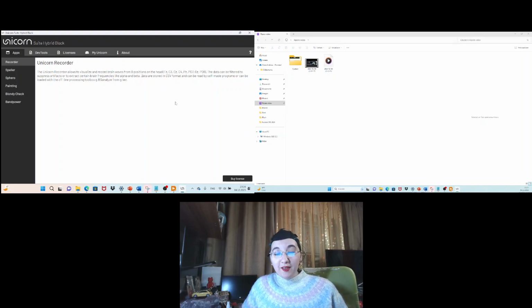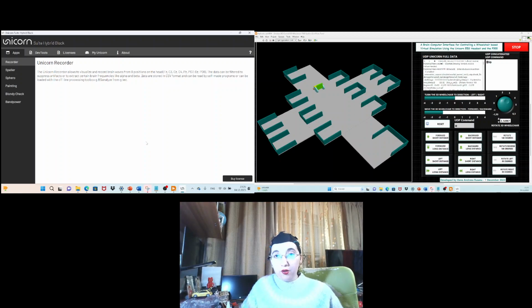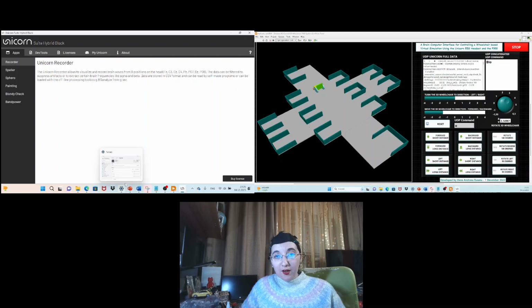environment. Today, I want to show you a live video demonstration of experimenting with the brain-computer interface based on P300 speller boards for controlling a 3D wheelchair in a virtual environment developed in the LabVIEW graphical programming environment. So, as you can see, at the current moment, I wear this headset, the g.tec Unicorn with 8 EEG sensors. So now I will check the quality of the EEG signal.